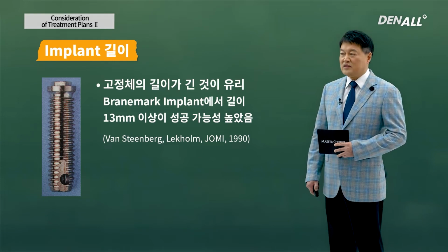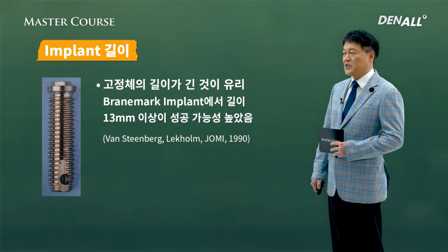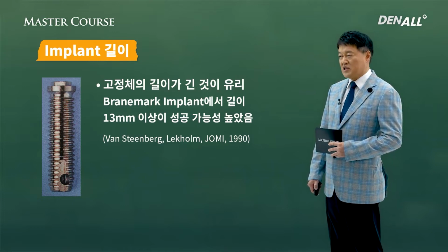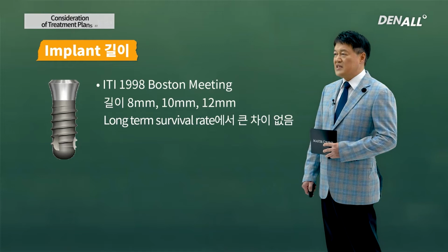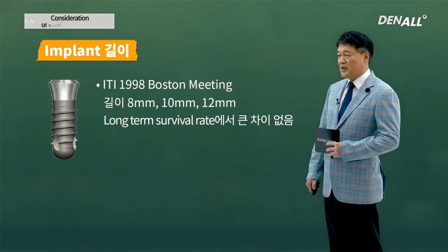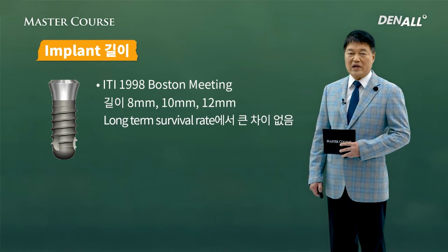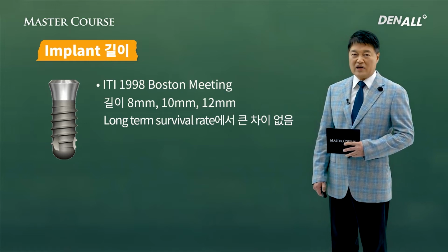Fixture length. During the days when we used Branemark system, long fixture was favored. 13 millimeter or longer was considered to have high success rate. It was machined surface, and the longer the implant, the better stability was achieved. However, according to ITI, the literature says that 8 millimeter, 10 millimeter, 12 millimeter, as for long-term survival rate, there was no significant difference. Different surfaces have been developed, so it no longer makes sense to place extra long implants.